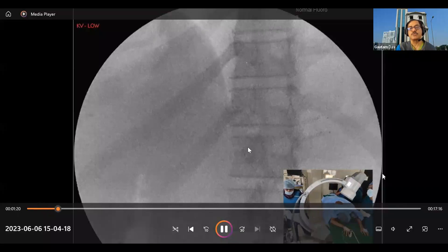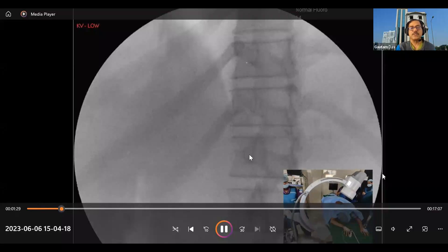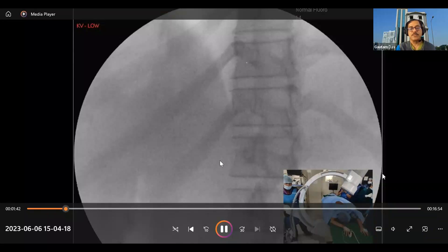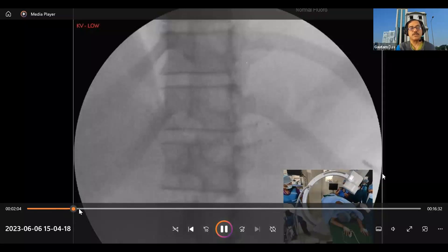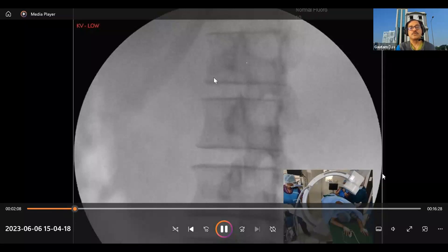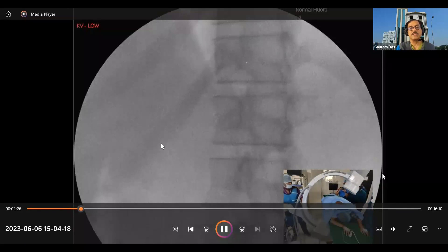With the oblique view, the transverse process is shorter and almost obliterated. At this point, the transverse process has almost vanished on the left side. We can imagine a triangle formed by the twelfth rib and the lateral border of the vertebral body. We then bring the area of interest to the middle of the screen.